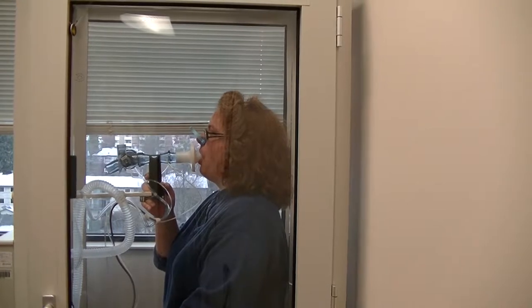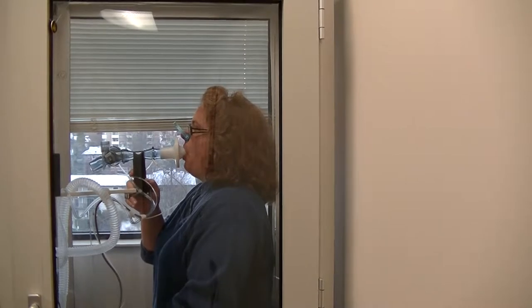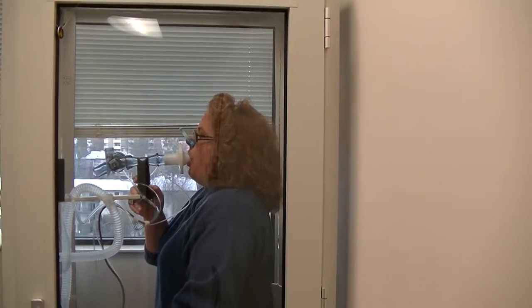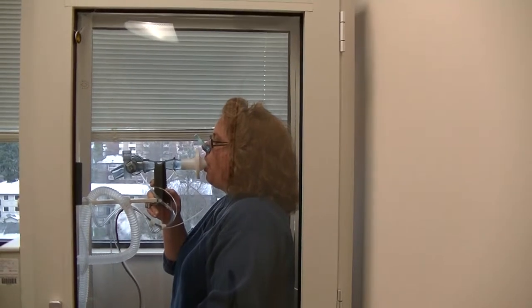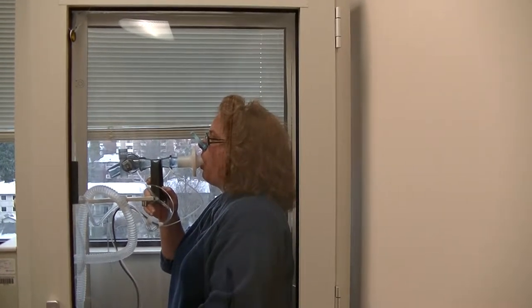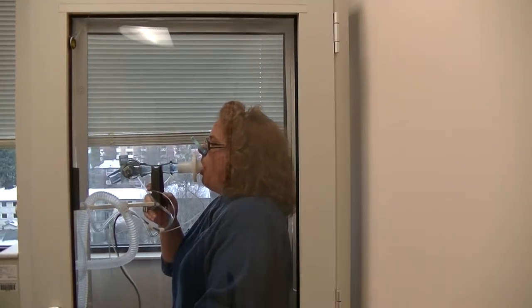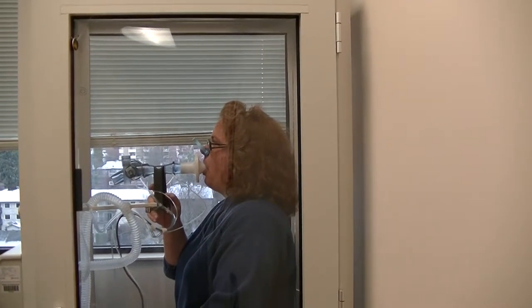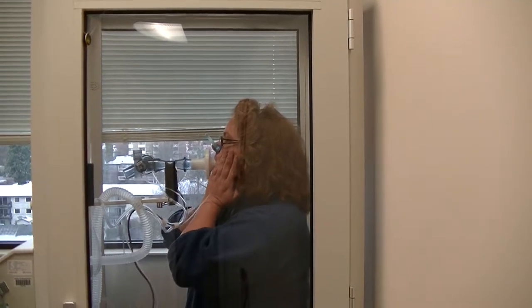Okay. I want your eyes open for this. We're going to go all the way — next breath, all the way in, deep as you can. You don't have to do it fast. Blow it out. Keep blowing, keep blowing, keep blowing. Now all the way in. And regular breathing. Breathe in and out, just your normal breathing. Good job.